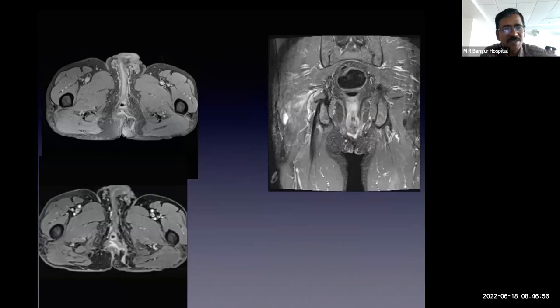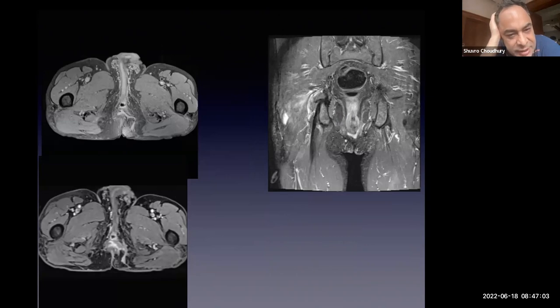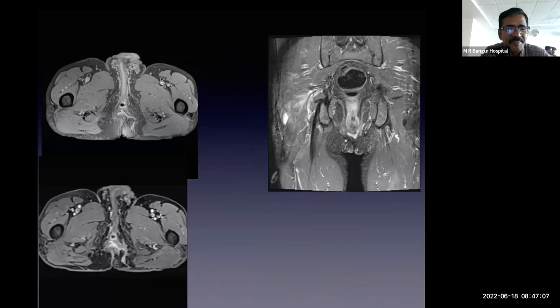Just show us some normal structures in these cuts. Here also, this one you can see. So let's try to do this. Yes, we can make out the fistula here on the left side. But this is the problem. It's all about going back up and down, to try to understand where it is. Without going up and down, I can't remember.